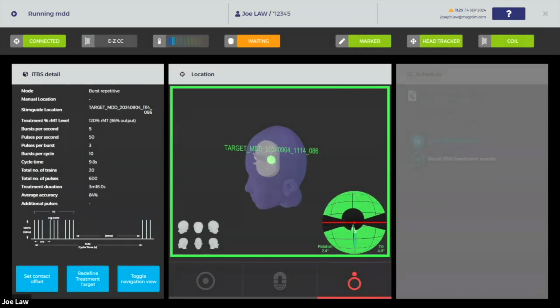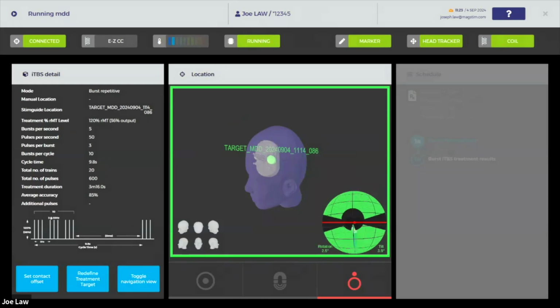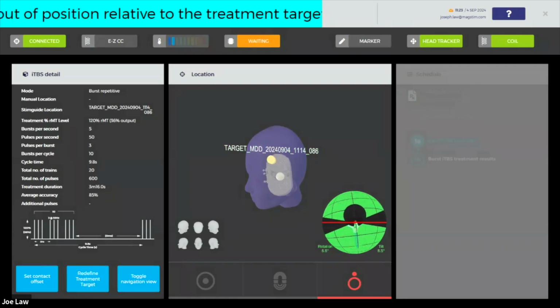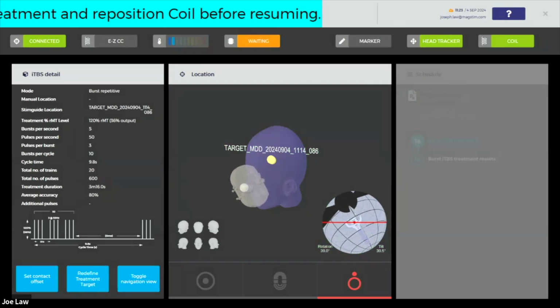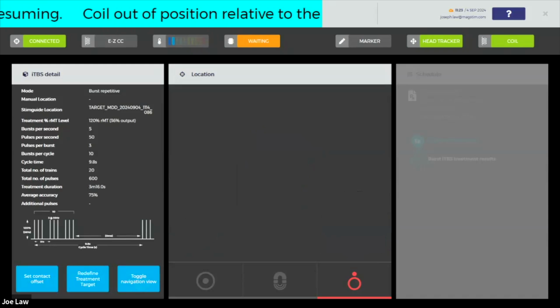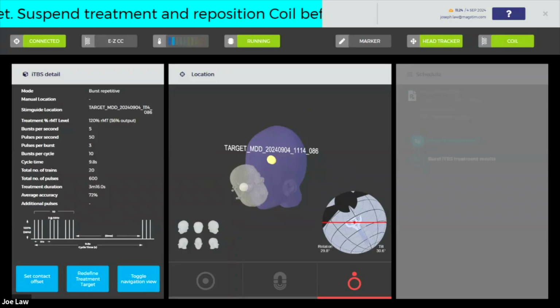So what I'd like to do is we've got 1 minute of treatment left. So what I'm going to do, extreme admittedly, is move the coil away from the patient's head. So we lose the location, but I'm also going to lose the orientation. What I'd like to do is simulate a poor treatment and how that records to the system. At the end of this treatment, it will give me a treatment score. And again, that'll be saved to my profile. So extreme, but it'll show you exactly how it works. So we've got 40 seconds left. We'll just allow that to finish by missing those last minute's worth of pulses.